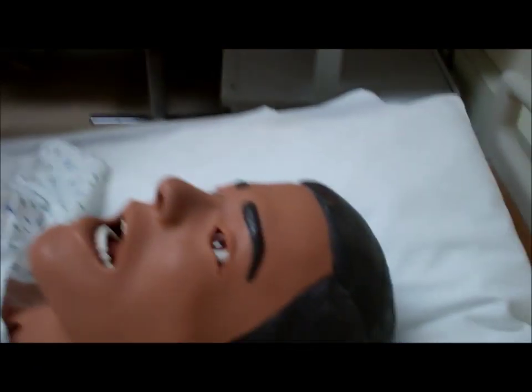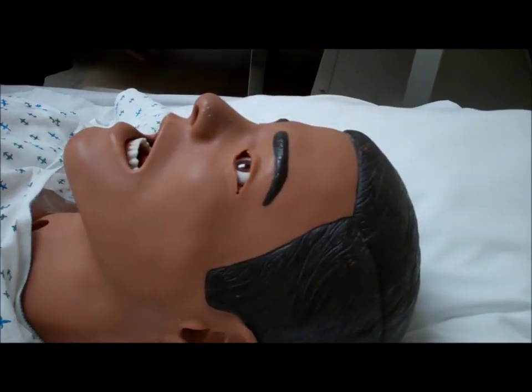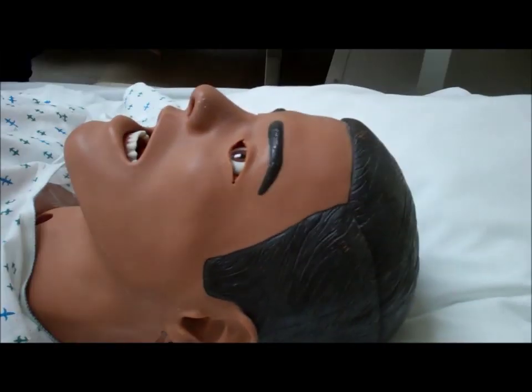Could you please state your name and your birthday for me? Alright, thank you. And do you have any allergies, such as to povidone-iodine, ChloraPrep, or latex? No, you don't? Alright, thank you very much.